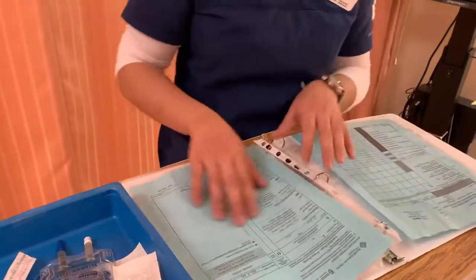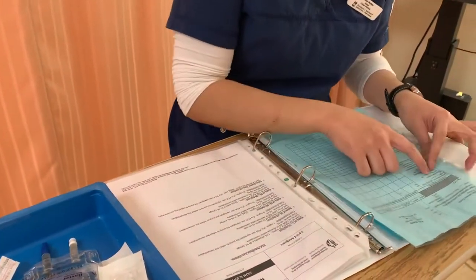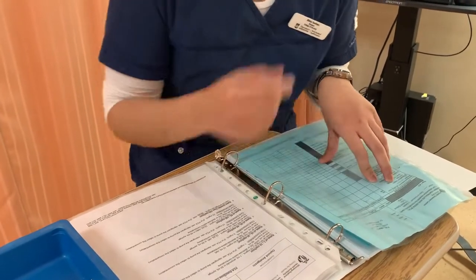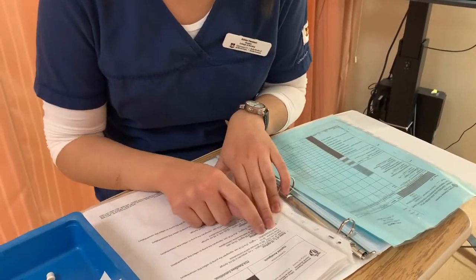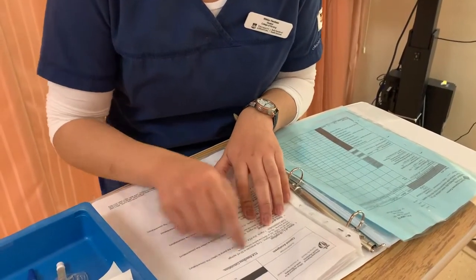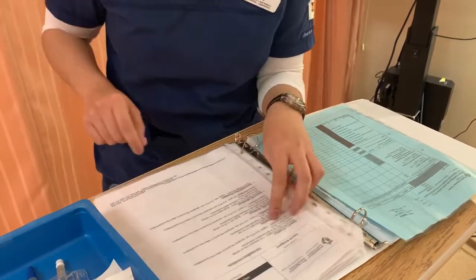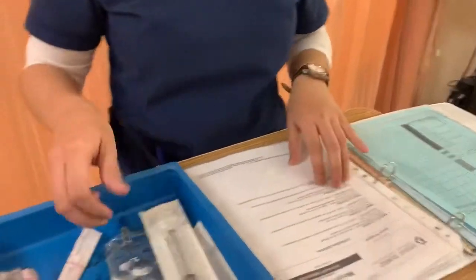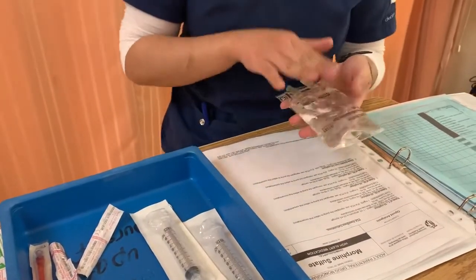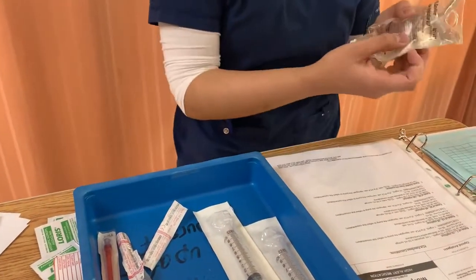So now what we're going to take a look at is the recipe for this. We have an order in the MAR that the morphine must be 1 milligram per ml as the final concentration. We're looking here at the PCA recipe with the 1 milligram per ml final concentration. So we're using this exact recipe. We need to draw 50 milligrams in the syringe, and then we need 45 ml normal saline. Because we're doing a Curlin, we can just leave the 45 ml in this medication bag or in the normal saline bag. We also made sure that it is normal saline and 50 ml.